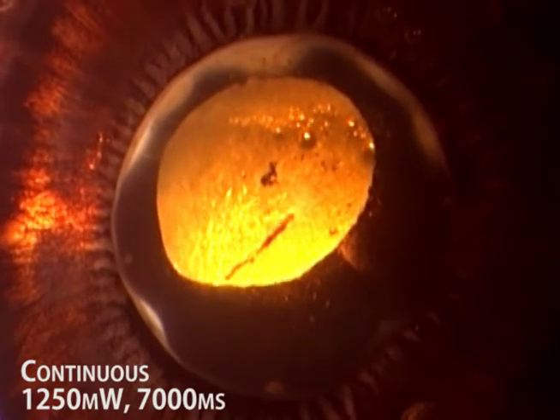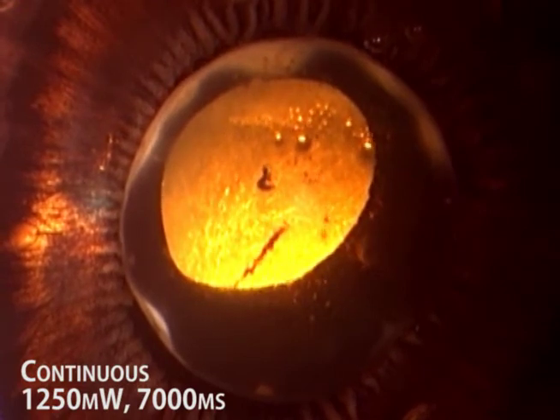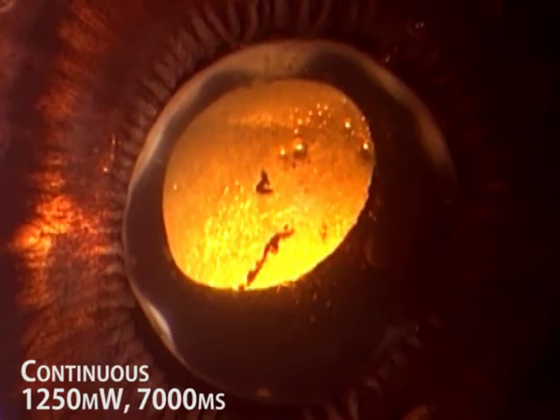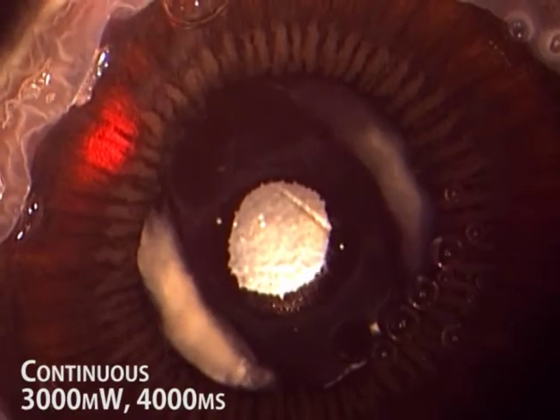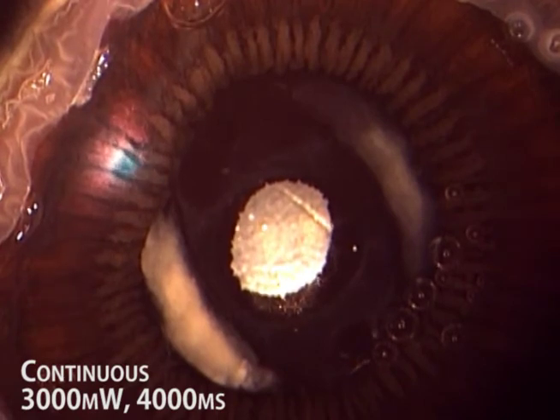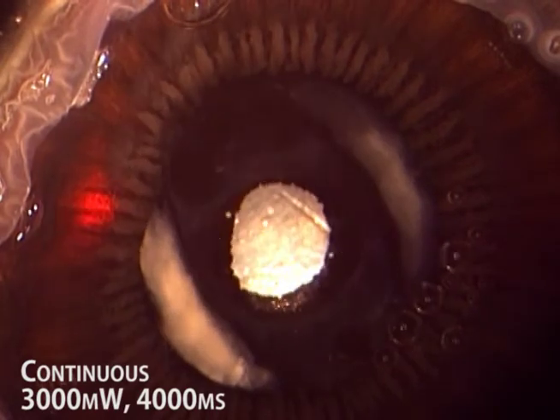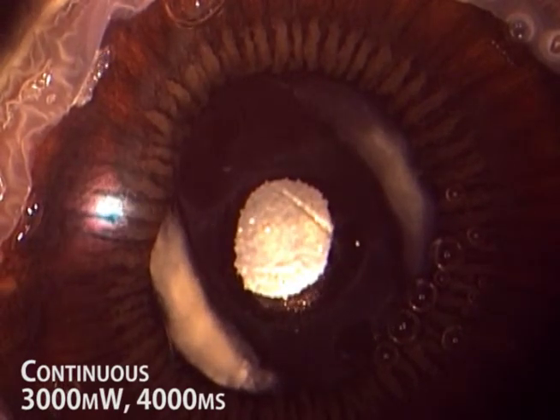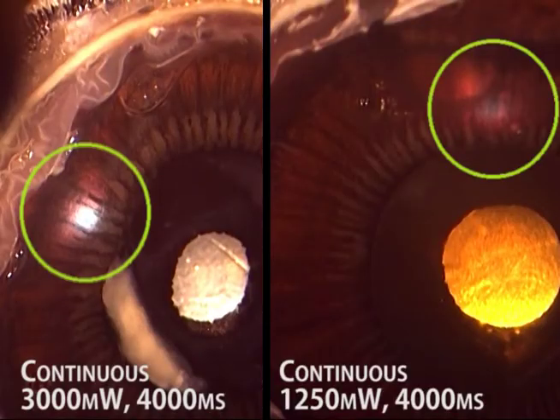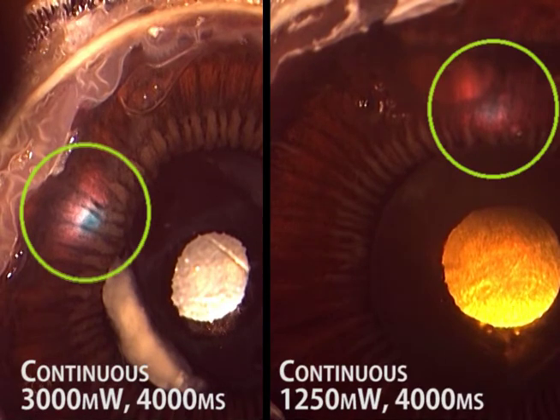This is the same lower energy with even longer duration. And here you see higher energy. This is a comparison of higher and lower energy at the same duration.